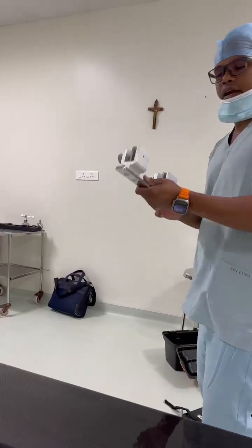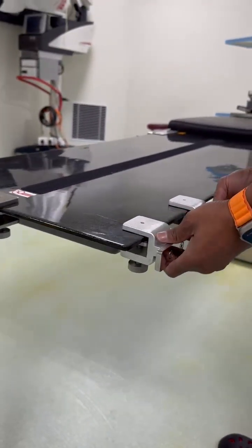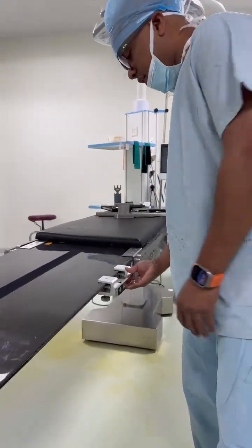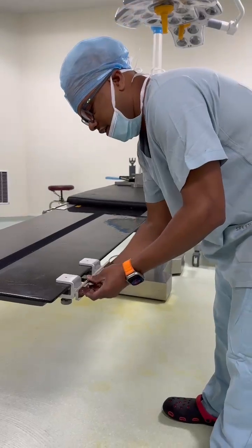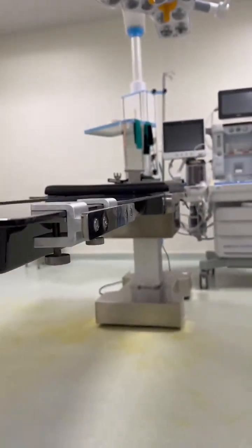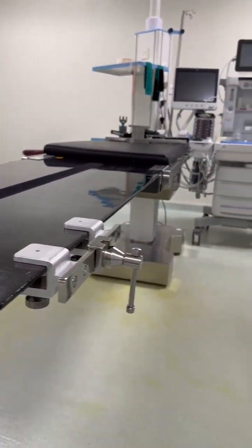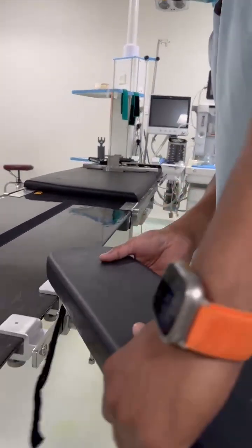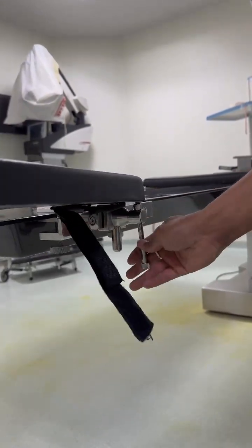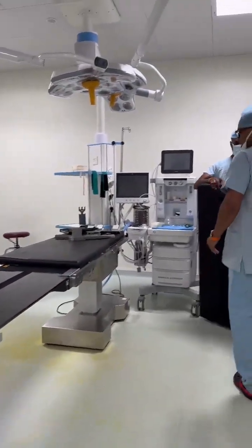We have a dedicated armboard clamp for this. You can attach it wherever the surgeon is comfortable, wherever they want to position the patient. Just attach it and tighten it in the bottom. Then take your armboard clamp, put it over here — this is your armboard — just tighten. That's it.